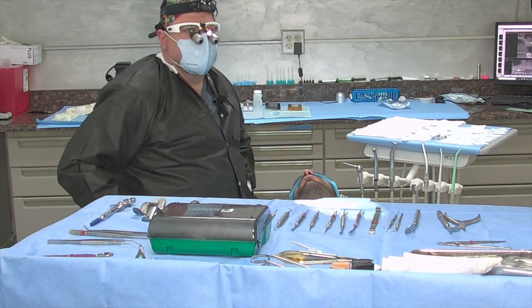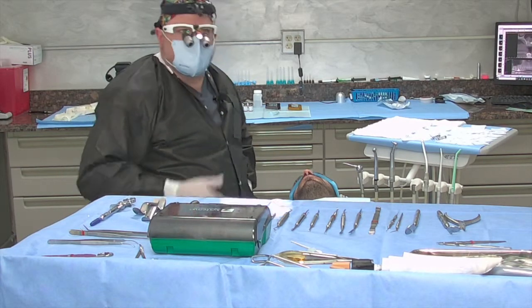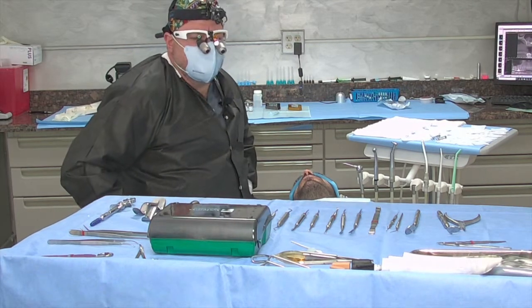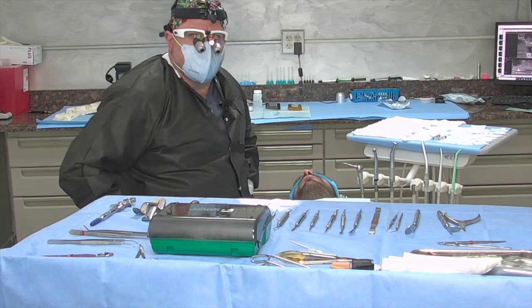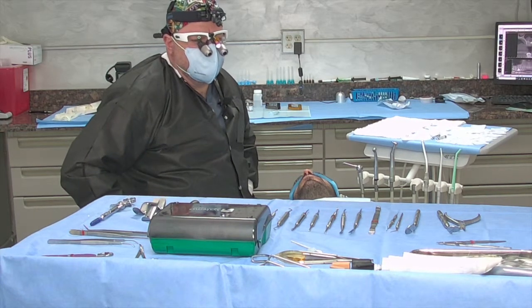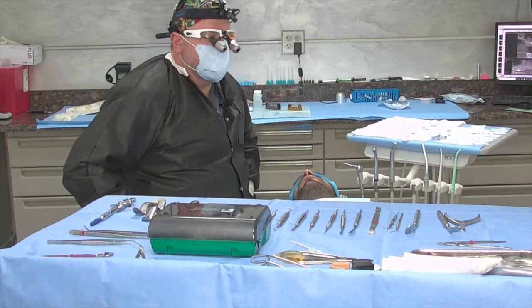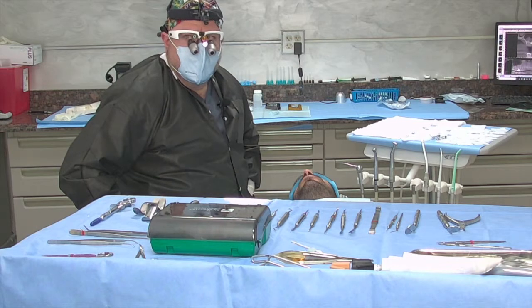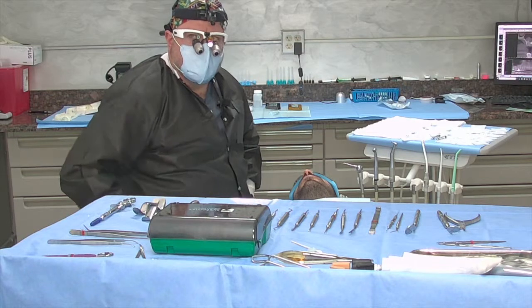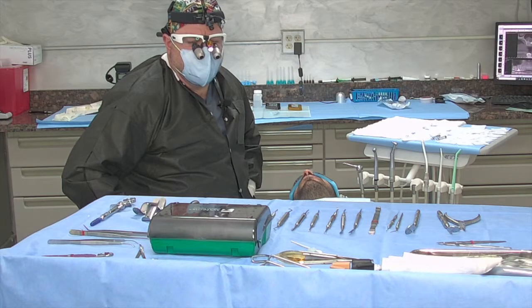So, Doc, you're taking the... We're going to do osteotomes. Okay. And there's all different types of systems. I think that there's all types of little machinery right now and different types of techniques to do this. For the past 25 years, one of the things with them is we're going to have to be a little forceful with pressure with the osteotome, possibly even use the mallet a little bit just to do a little green stick fracture. But to gain 2 millimeters should be no problem with what we're doing. It's going to be very nice and easy and predictable.